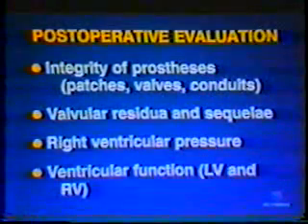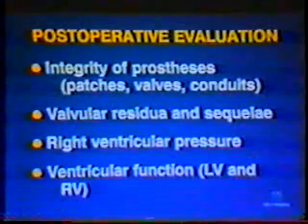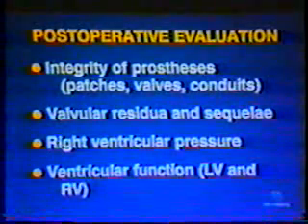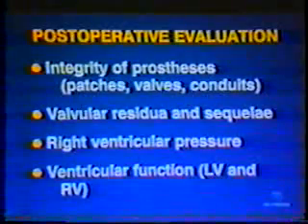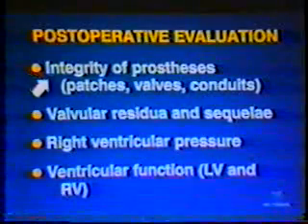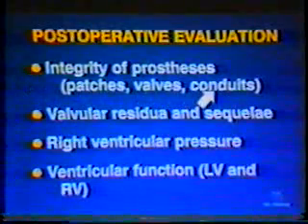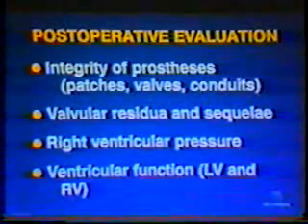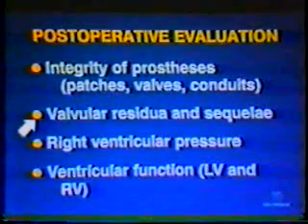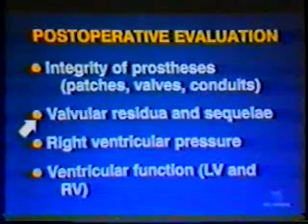A systematic approach must be followed as has been emphasized in the previous discussion. A general approach to the post-operative congenital cardiac is shown here. The integrity of prosthesis must be established. Prosthesis may be in the form of intracardiac patches, valves, or conduits. Many congenital cardiac anomalies leave behind valvular residua and have sequelae. These must be systematically evaluated.